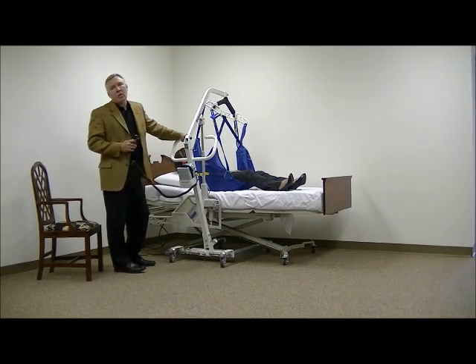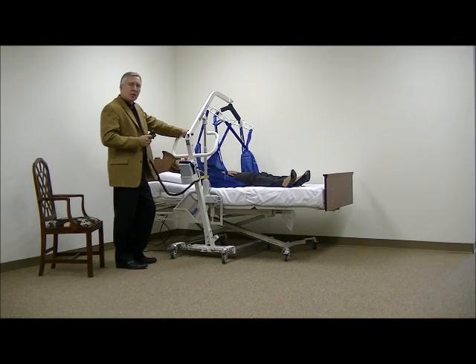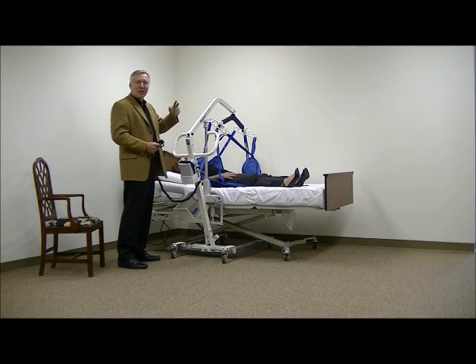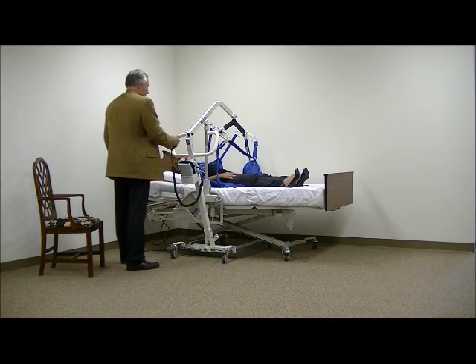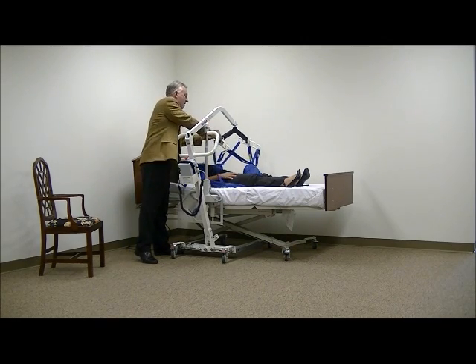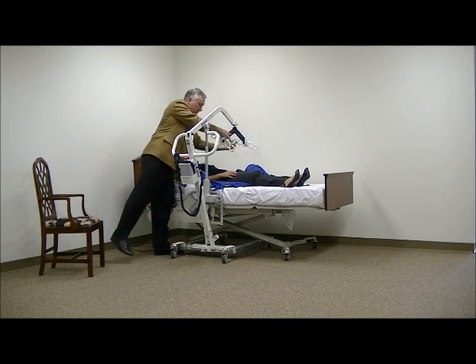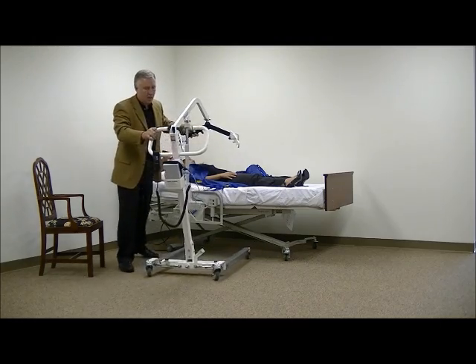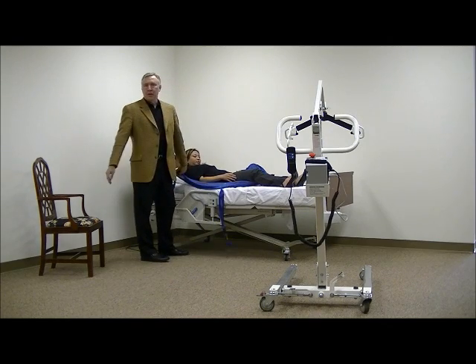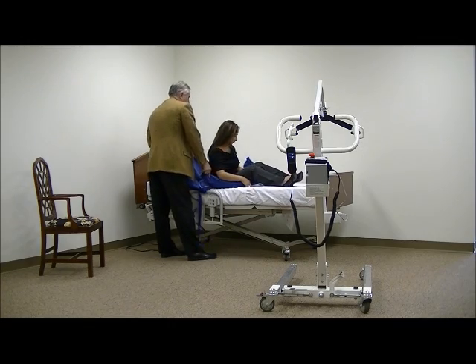Now after we get this patient down, we're going to demonstrate how you would apply the sling to the patient while they're in bed, because that's a little more difficult than applying it when they're in the chair, because of the way you have to move the patient to get the sling in position. So we're down good enough to remove the sling. Now, when a patient's in bed, of course the sling's not typically underneath them like it is now. So I'm going to go ahead and have you sit up just to remove the sling.